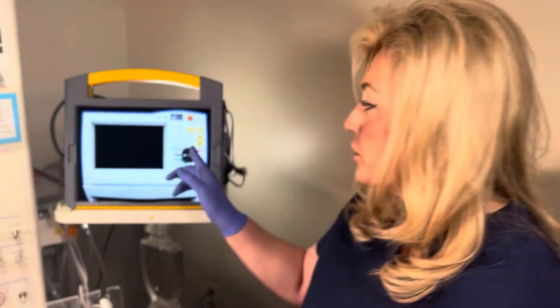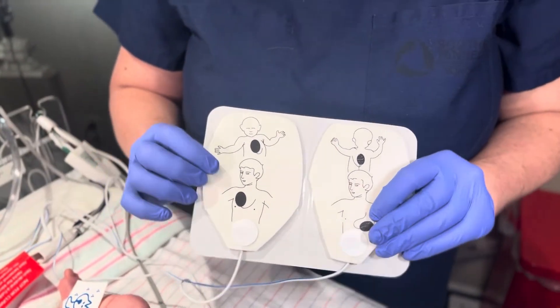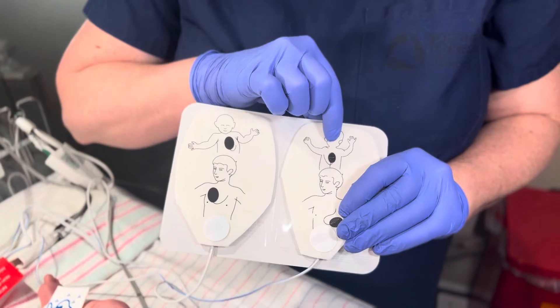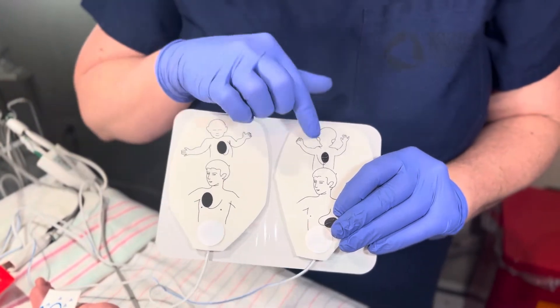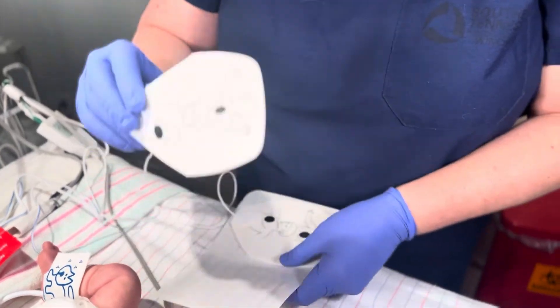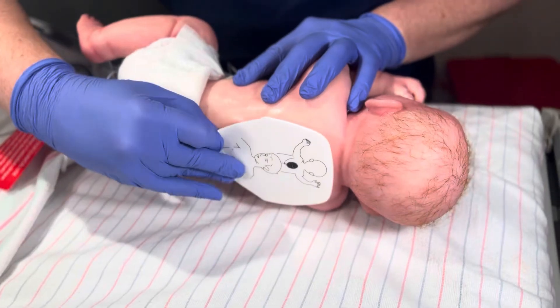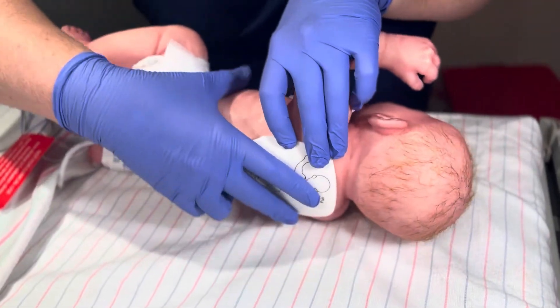The first thing you'll need to do once your defibrillator arrives at the bedside is apply your quick combo pads. You'll need to apply them in an anterior-posterior method, or front and back as seen here. The first step will be to peel and place it on the baby's back by rolling the baby to the side and applying it firmly to the baby's back.